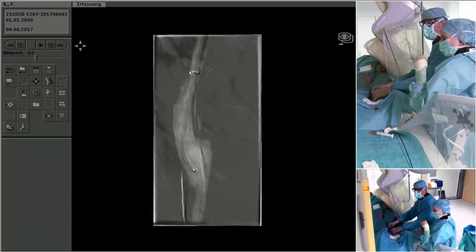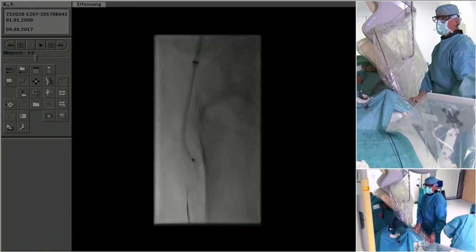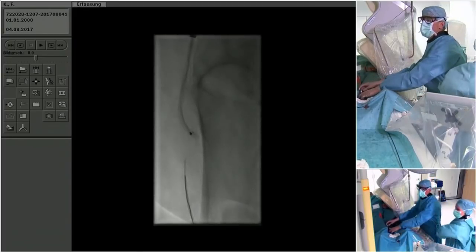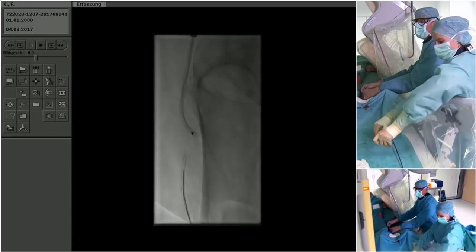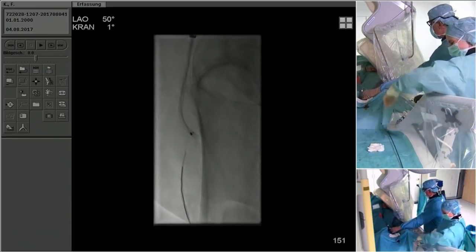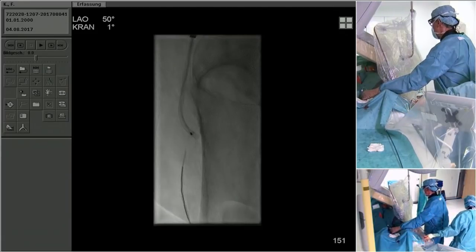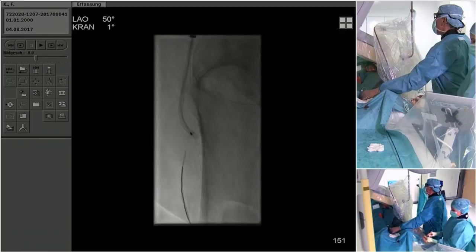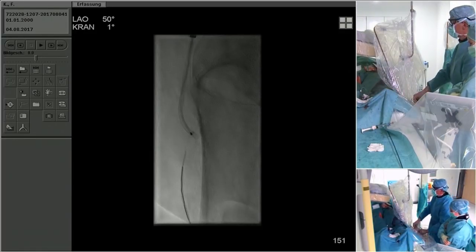Okay, once again, I try to give it a better angle to the common femoral artery. So this, for example, is a good angle to poke a little harder. However, of course, not before I have again changed CR position and checked. Now CR doesn't move. Please.